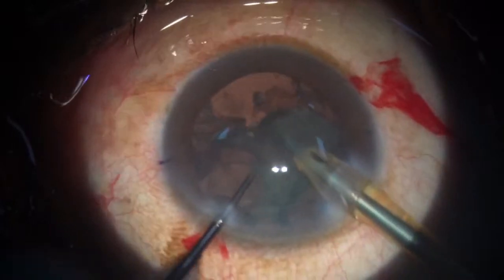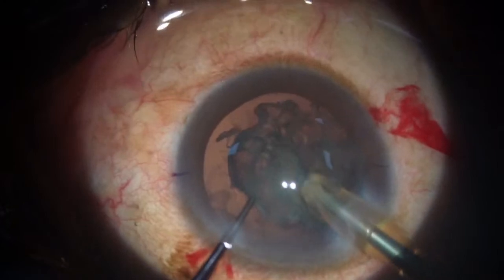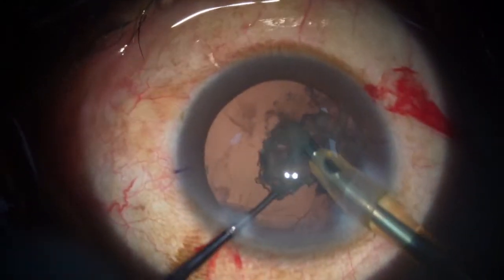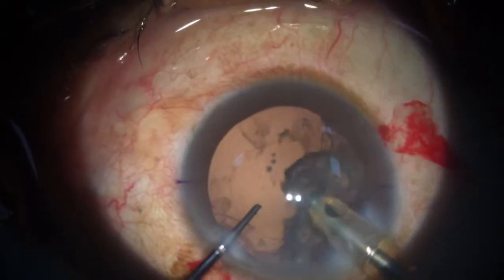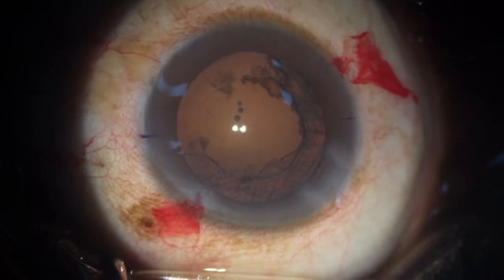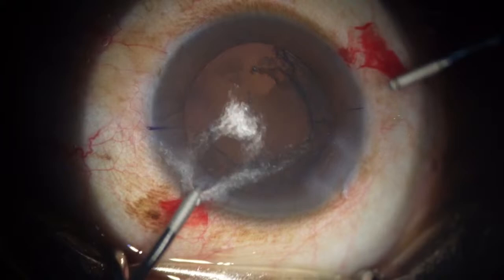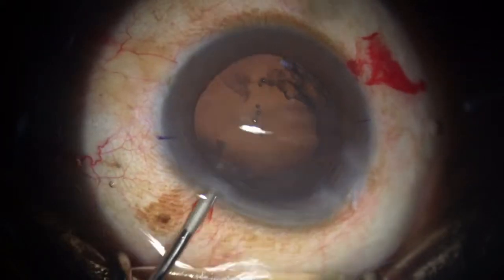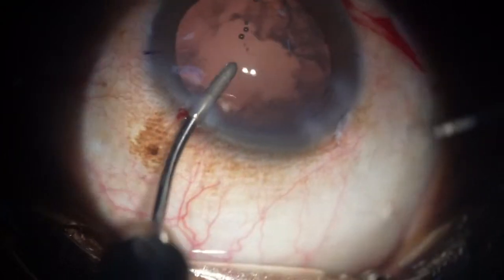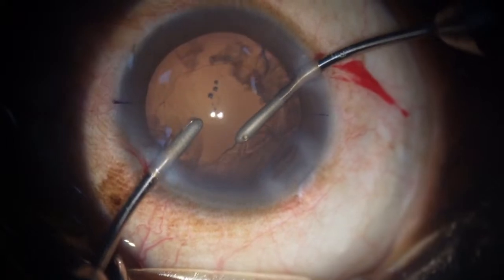Actually, for these patients where I don't really need to switch the mode, where I need to get into the quadrant removal, then I'll just switch it, because when you need more flow. So I'm going to use these customized bimanual IA systems which are sandblasted and made 22 gauge, except that I did not have 22 gauge knives again. So I've tried to make a 22 gauge side port with the 20 gauge MVR. So let's see. It's mostly non-leaky still.